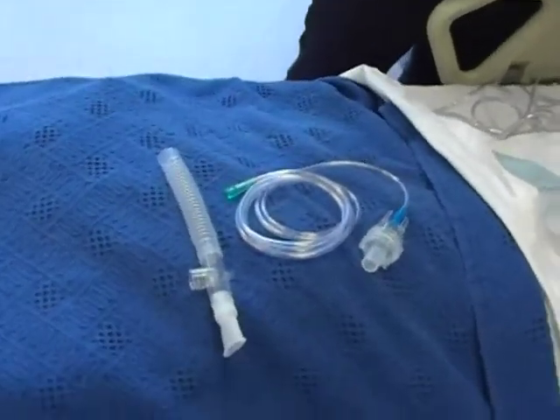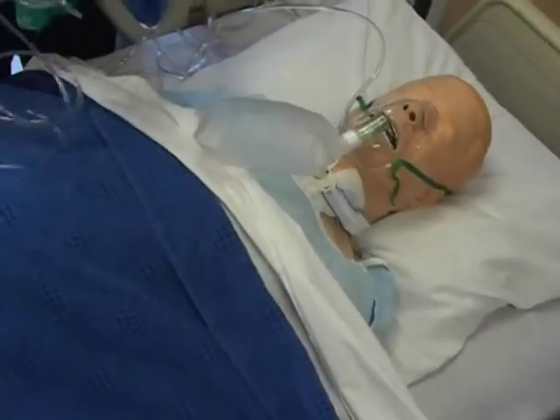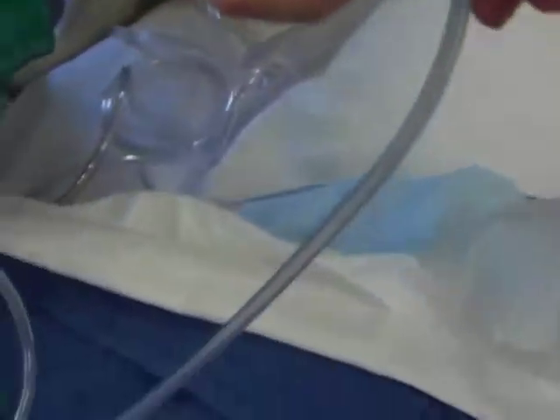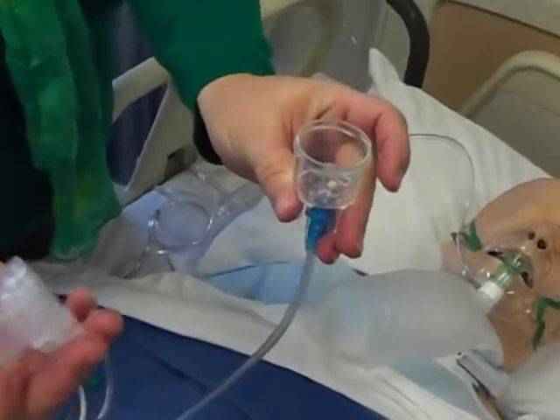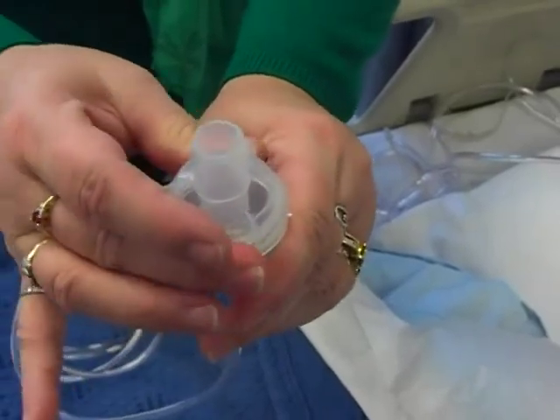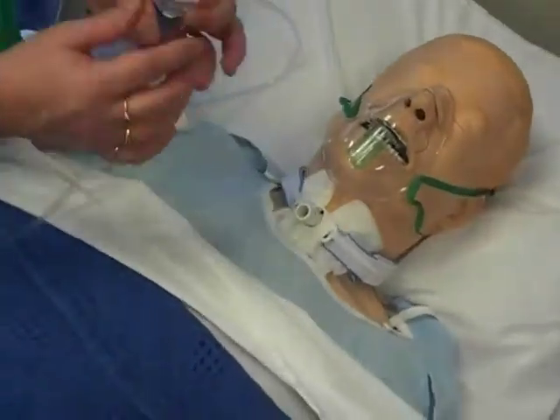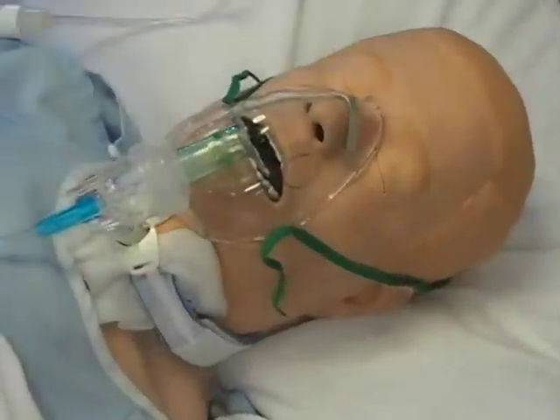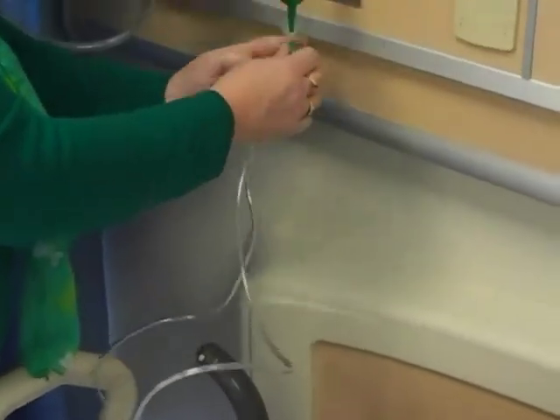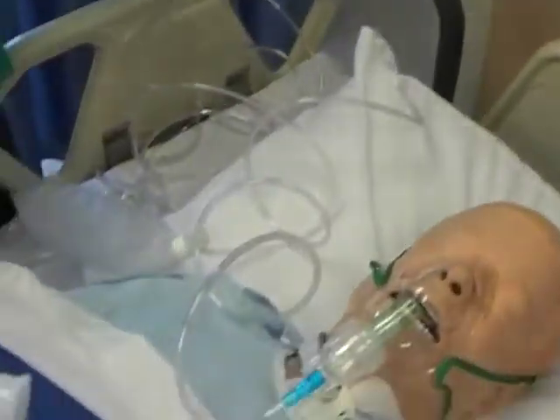We have ones that we can connect to a mask like this — it's simply a chamber that looks like this with O2 tubing connected. They open this top up and instill the medication — albuterol nebulizers. Twist that back on and then they can put it on a mask. This is used for patients that aren't able to hold on to what we call the peace pipe, but it's a nebulizer treatment.